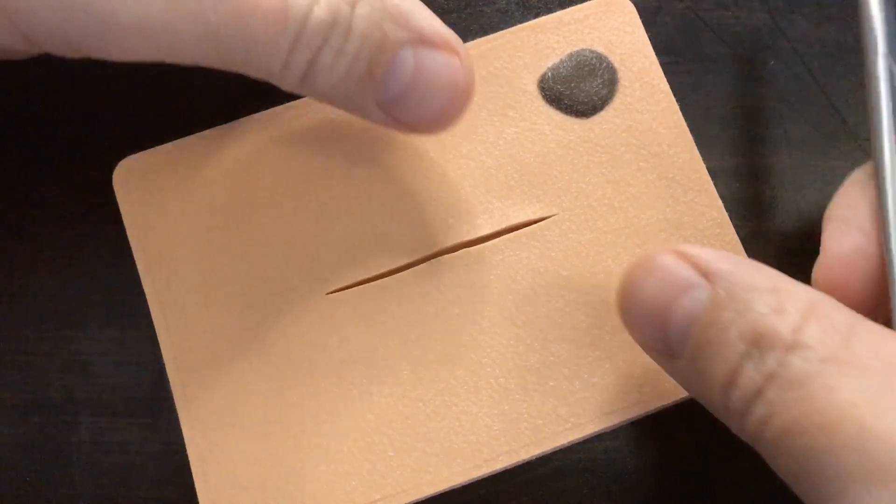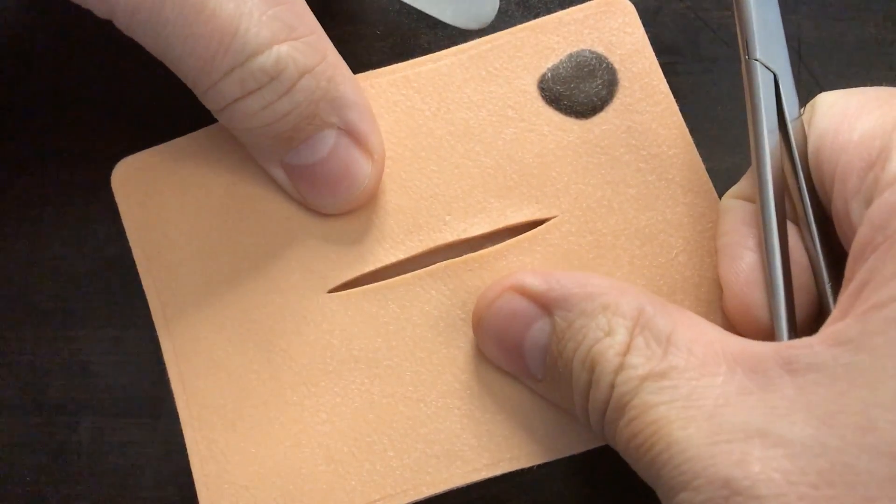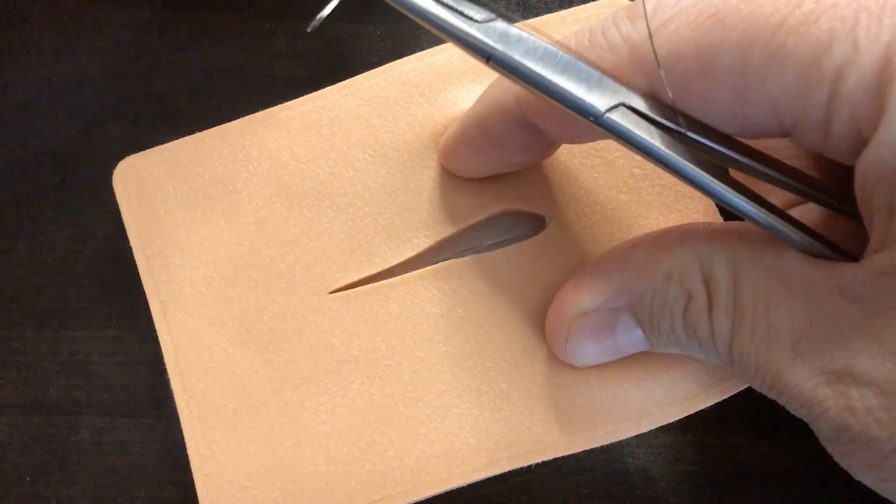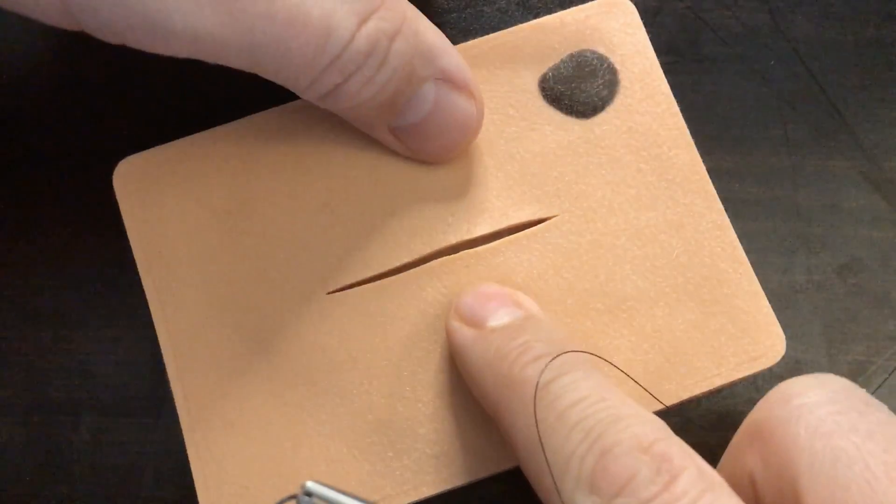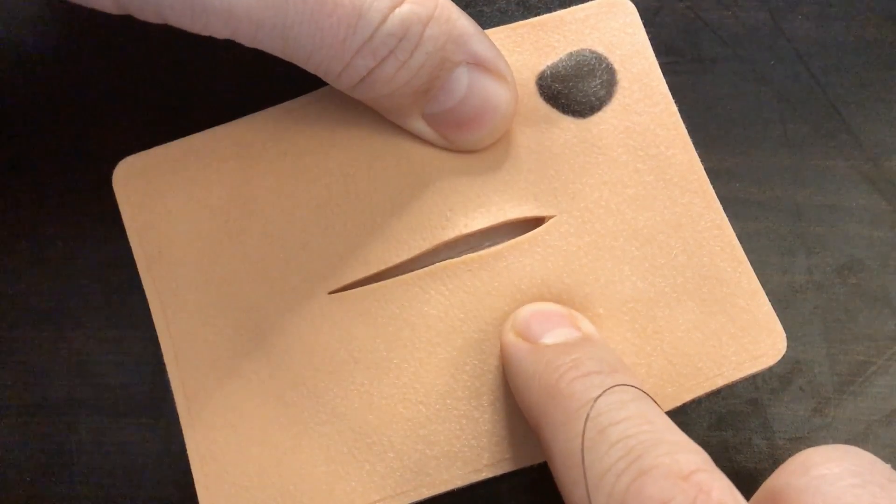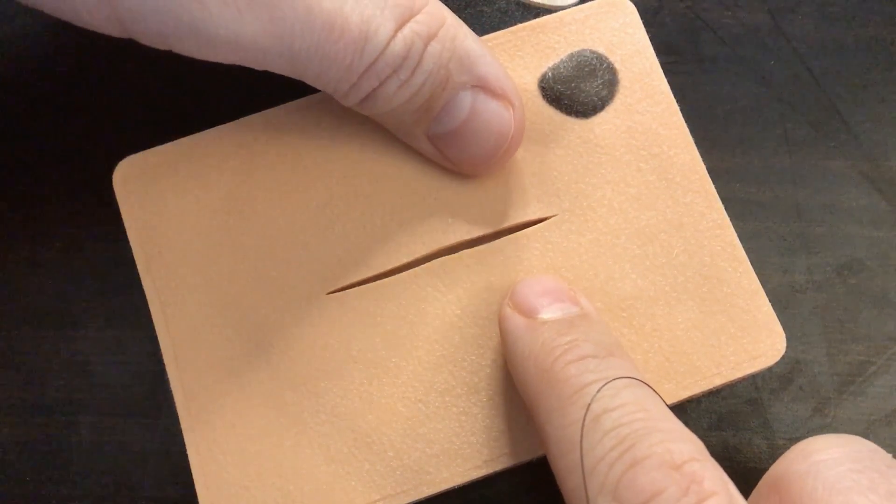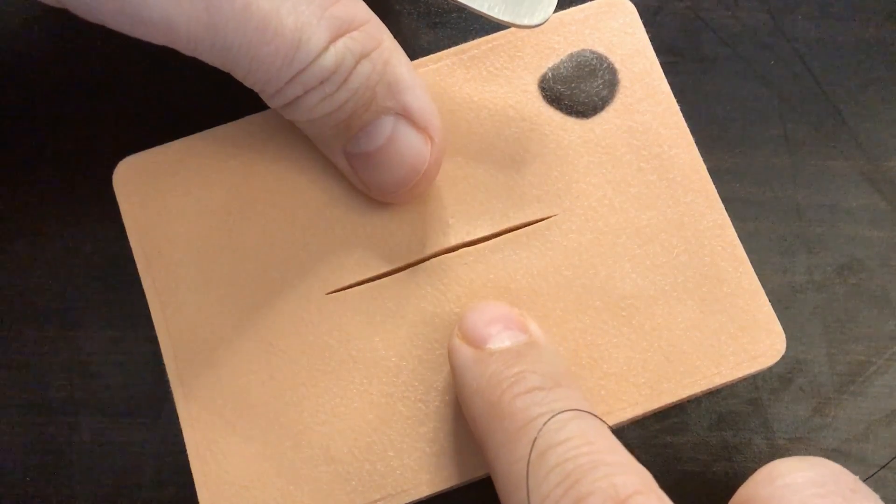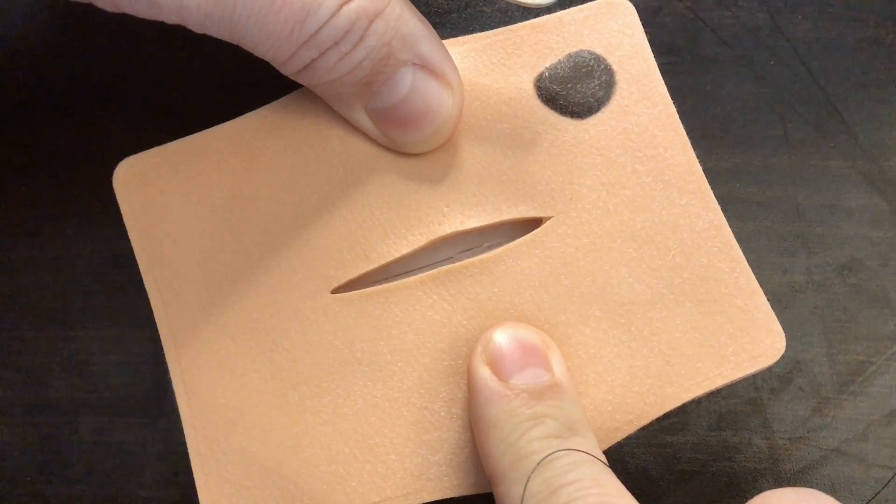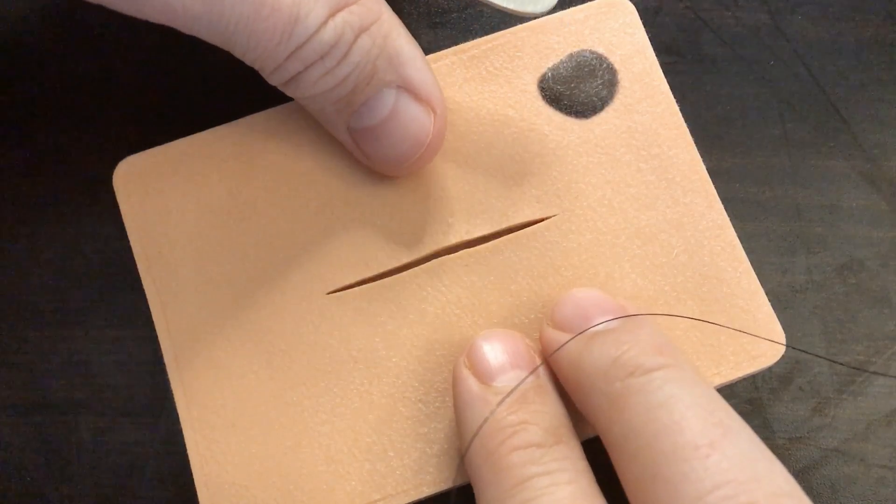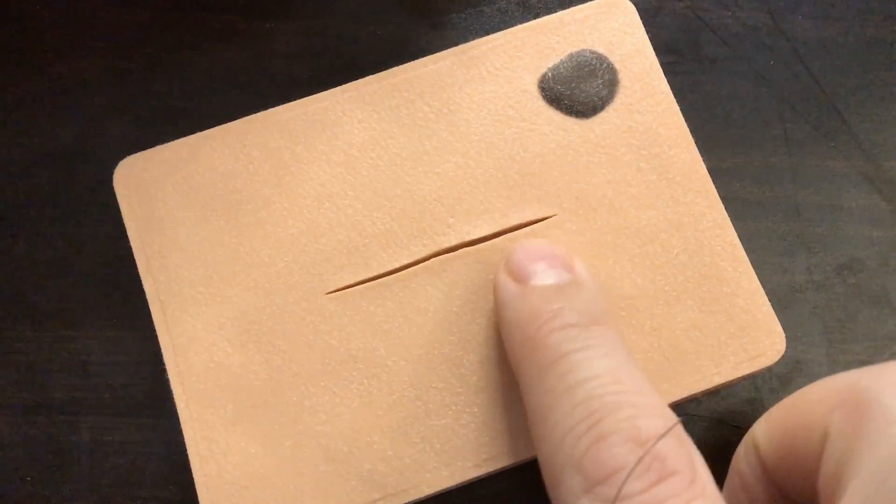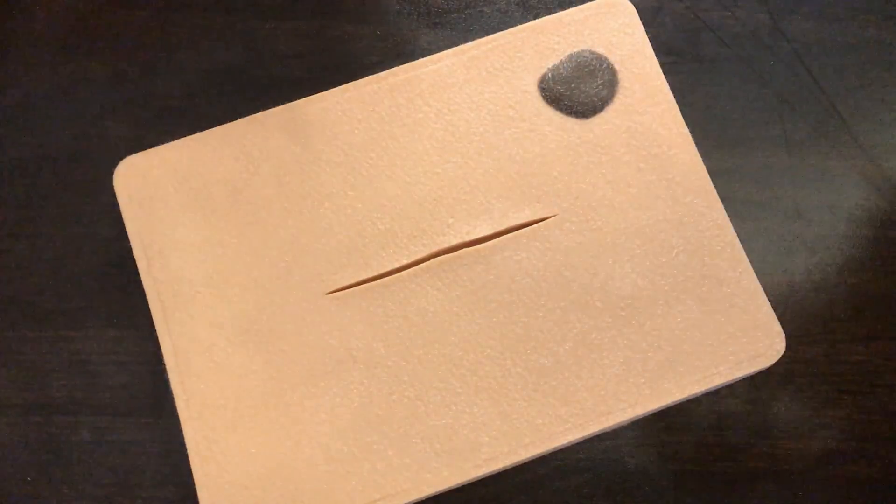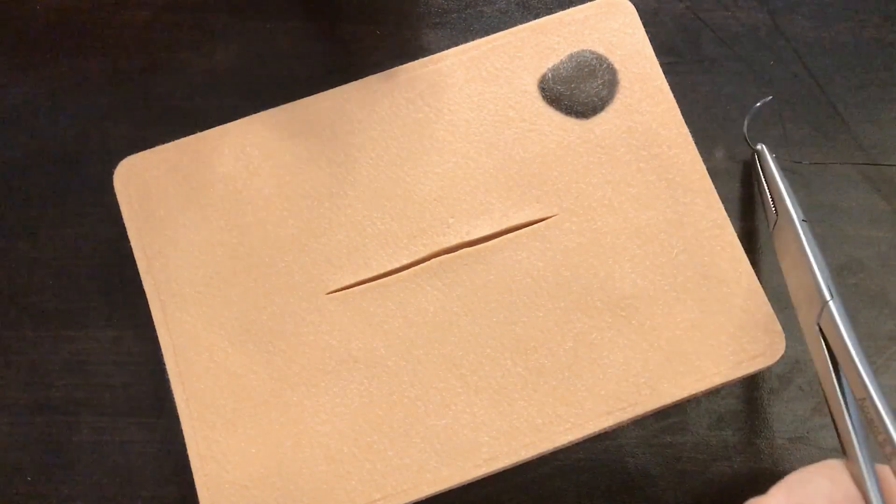Now subcuticular suture, if we're going to be closing skin level with subcuticular suturing, the wound should already be pretty well approximated. It shouldn't be big and gaping like this. If the wound is gaping it wouldn't be appropriate to use a subcuticular stitch because it's not a strong suture. You're passing suture through soft tissue that's easy to rip open, so if there's a lot of gaping pressure from the outside then you want to use a different suture technique. But if it's already pretty well approximated and the depths of this laceration are either not needing closure or have already been closed, then a subcuticular suture is a good method.